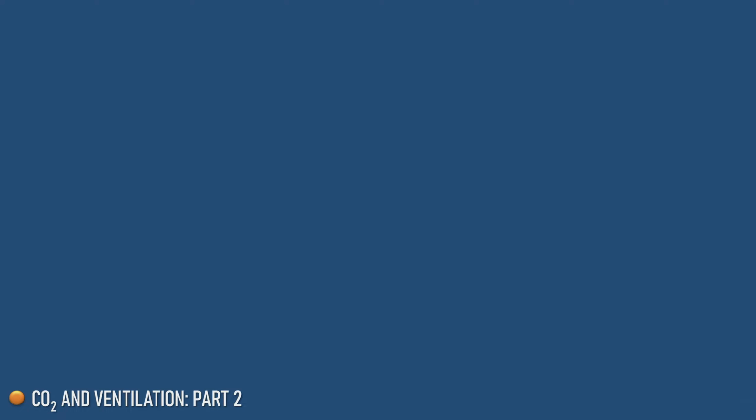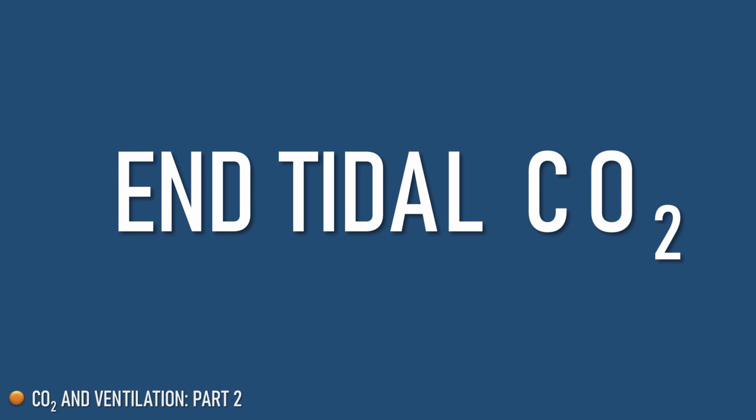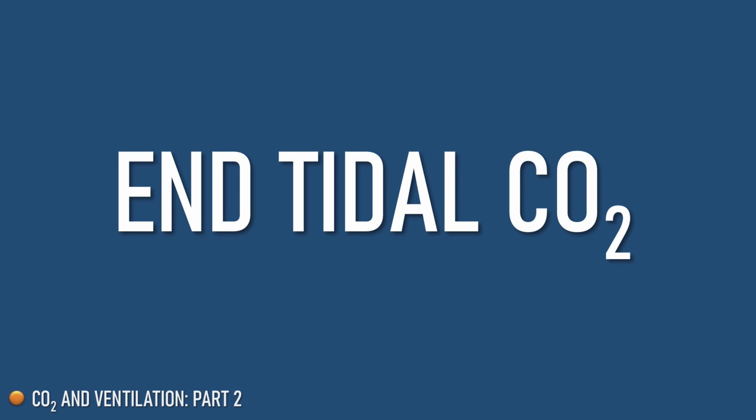The reason why is that this monitor looks at cellular metabolism, it looks at blood flow through the body, that's cardiac output and venous return, it looks at gas exchange across the pulmonary capillary interface, and of course it looks also at alveolar ventilation. So it's a tremendously useful monitor, and that's what this tutorial is about: end-tidal CO2, end-tidal carbon dioxide.